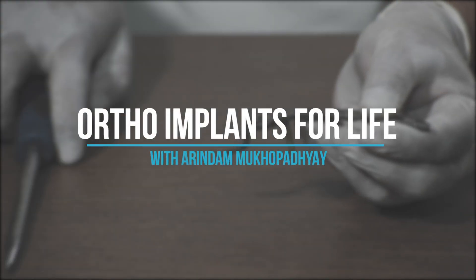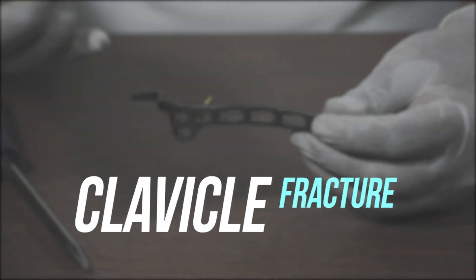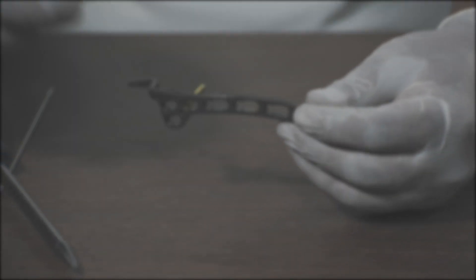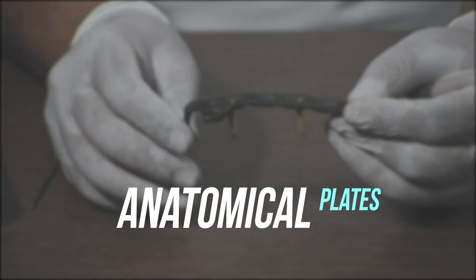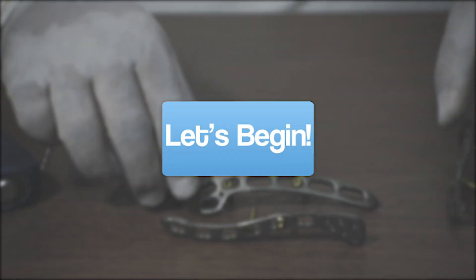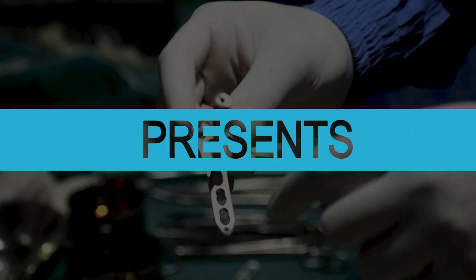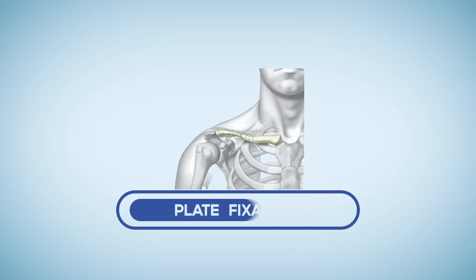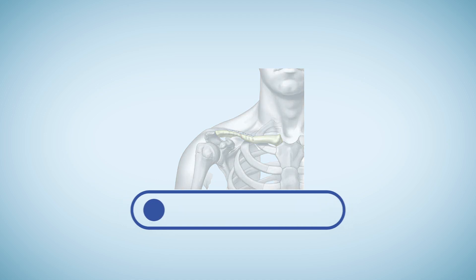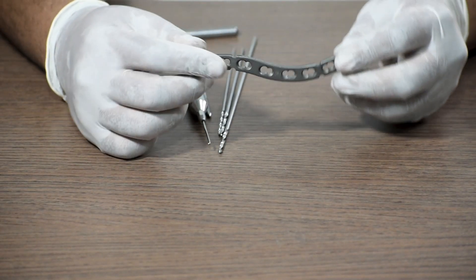Hello everyone, welcome to Ortho Implants for Life. Today we will discuss clavicle fracture and its anatomical plate fixation procedure. We will start with the clavicle medial locking plate.